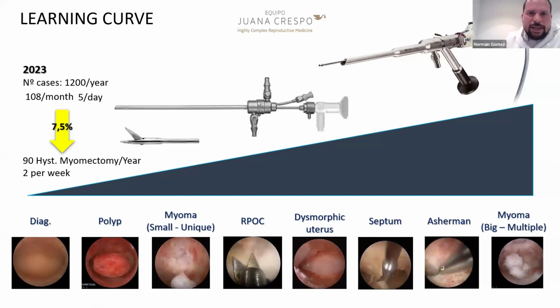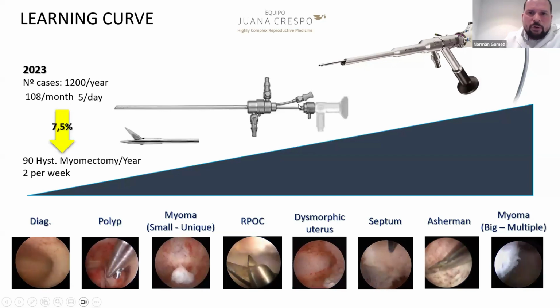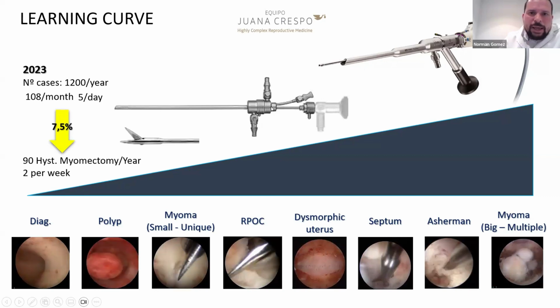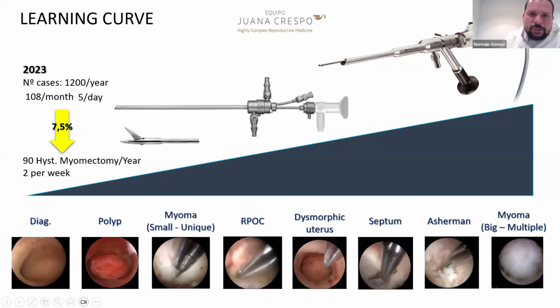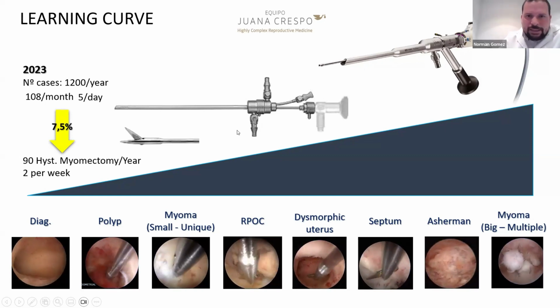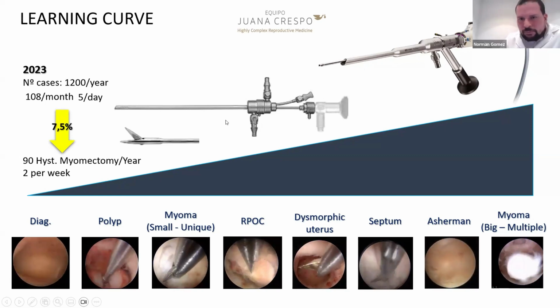But I must tell you that, in my opinion, you can approach at least 80% or 85% of your cases with the simple Bettocchi instrument.